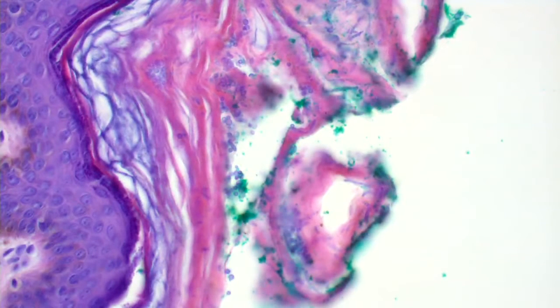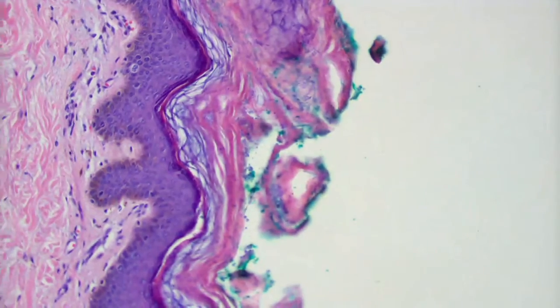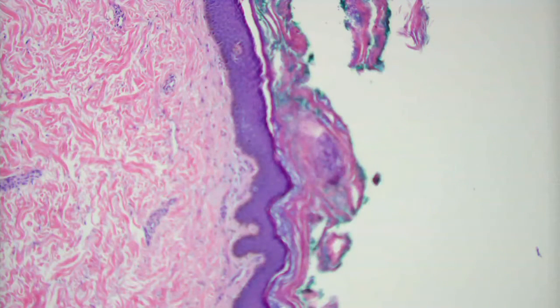Now, what else is in the differential diagnosis when you see this in the cornified layer? The first thing I thought of, when I saw it without seeing all these, was CARP. Good, based on how it looked. Yeah, that's one thing you would think of just looking at the epithelium. If you didn't see the cornified layer, CARP is a good idea. In fact, sometimes these patients look a lot like CARP clinically also. They have tinea versicolor. So yeah, that's one thing.